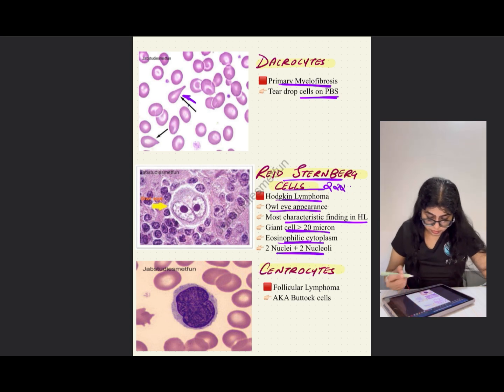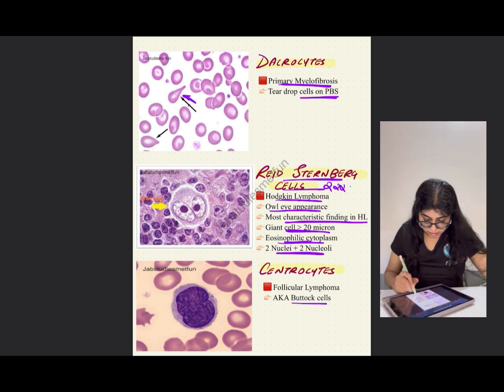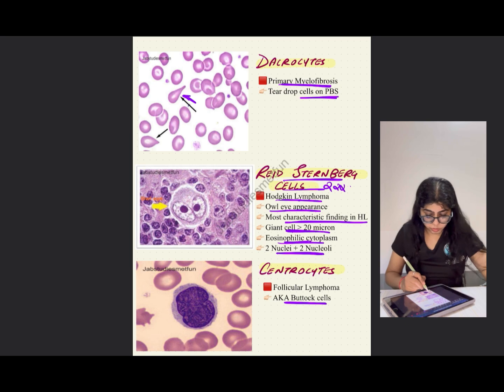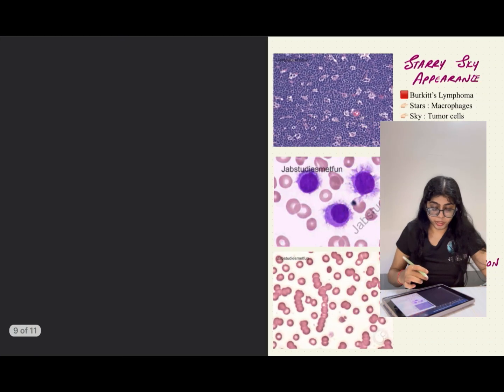Centrocytes, also known as buttock cells because of the shape of the chromatin, are seen in follicular lymphoma.